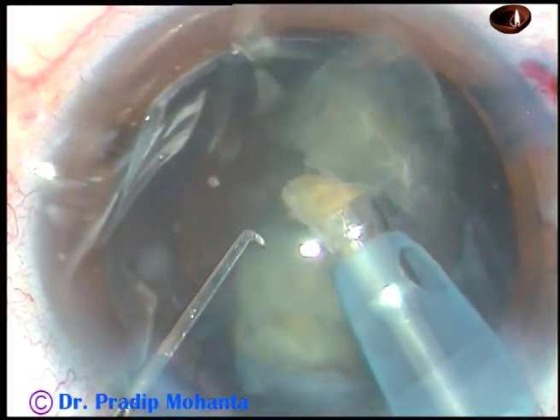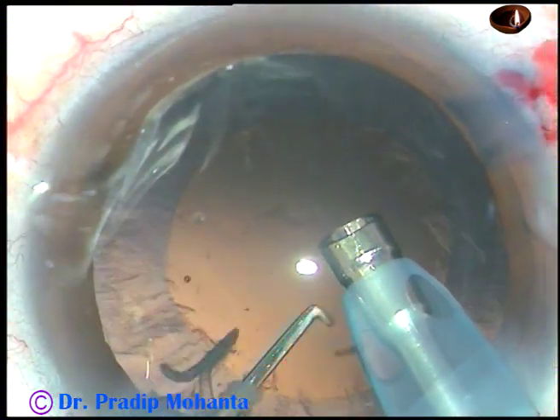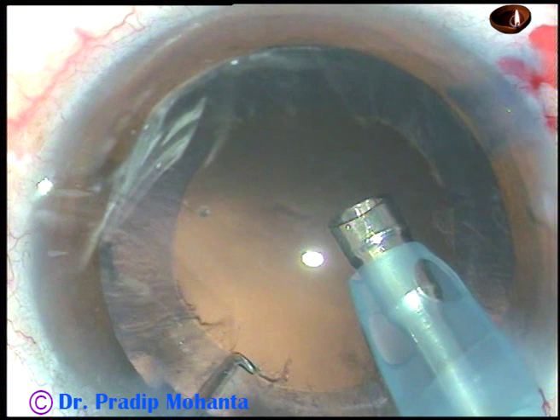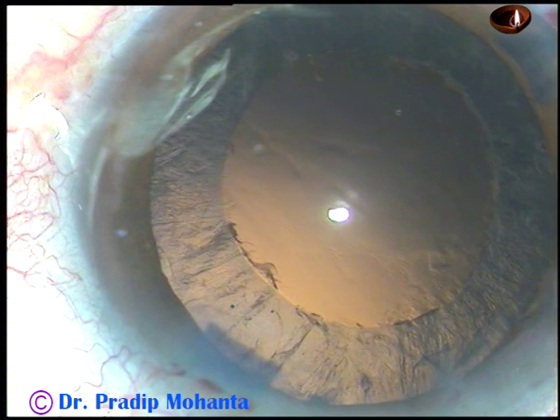This is the last fragment and we must take adequate care at this time. We can decrease the vacuum and flow rate to keep the chamber more stable.